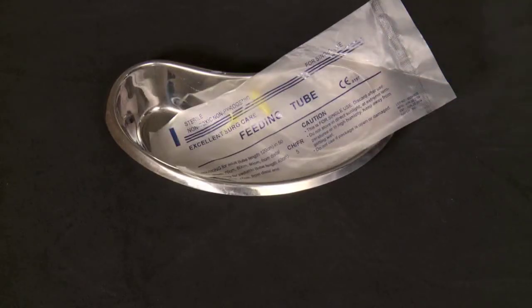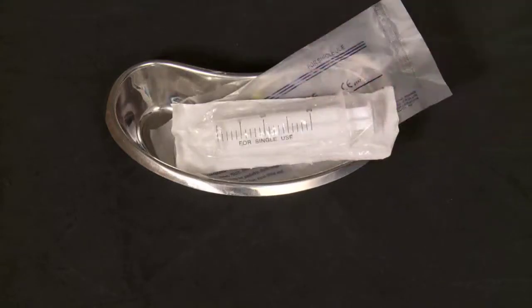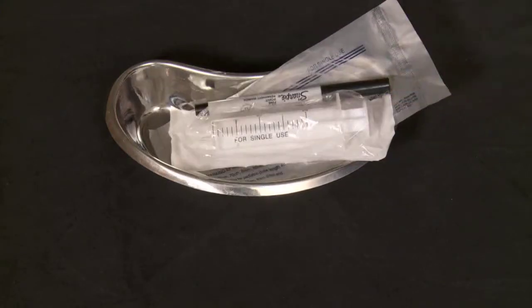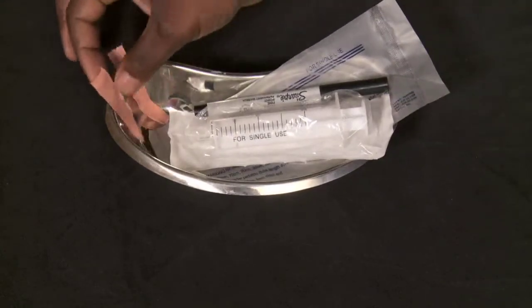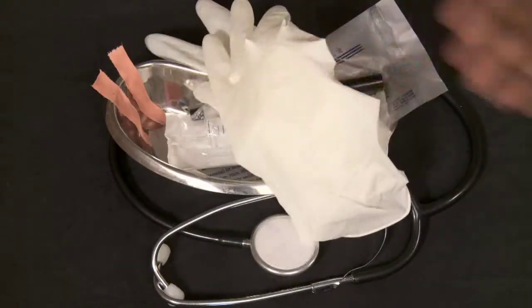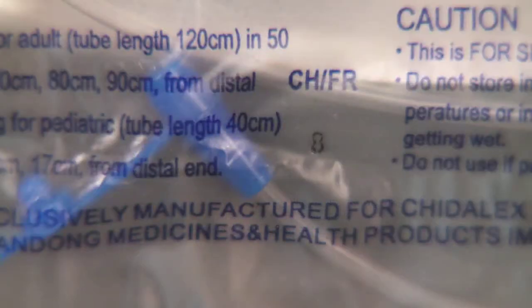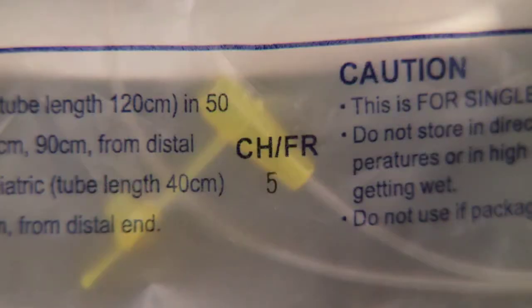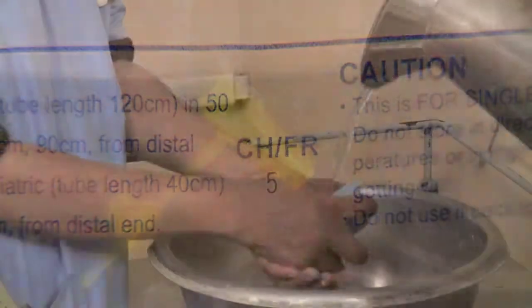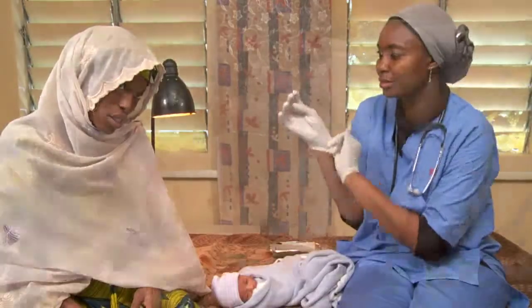To start, gather the gastric tube, a 5 milliliter syringe, a feeding syringe, a marker, tape, and a stethoscope. Gloves are optional. An 8 French gastric tube is a good size for a normal newborn, and 5 French is best for a small baby. Now, wash your hands and put on gloves.